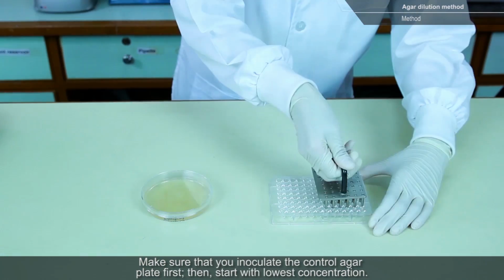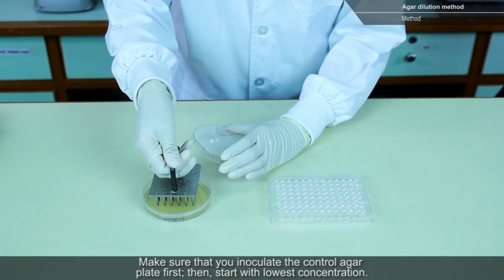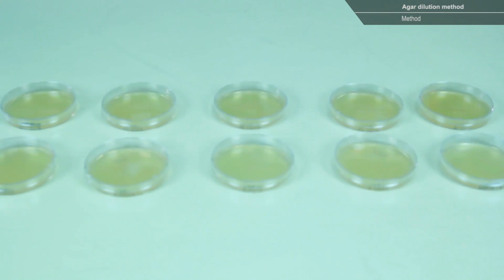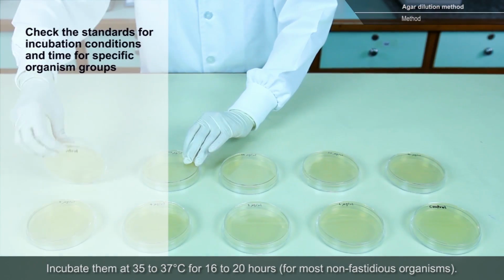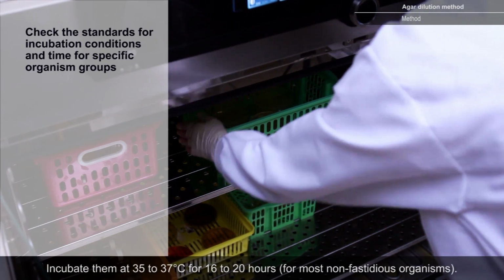Make sure that you inoculate the control agar plate first, then start with the lowest concentration. After the spots are dry, invert the plates and incubate them at 35 to 37 degrees Celsius for 16 to 20 hours.